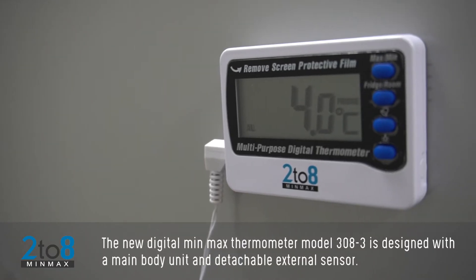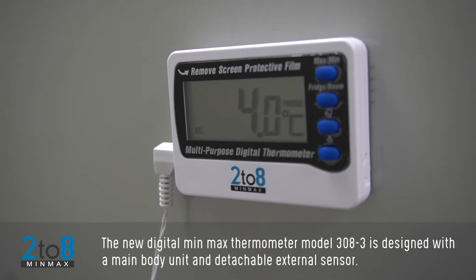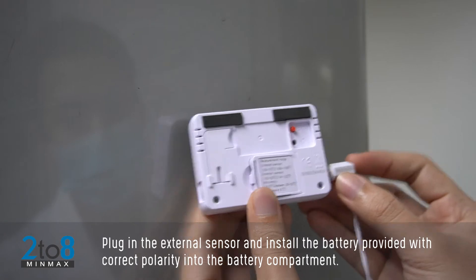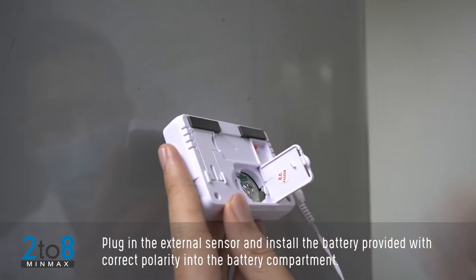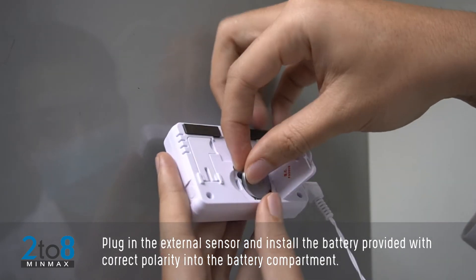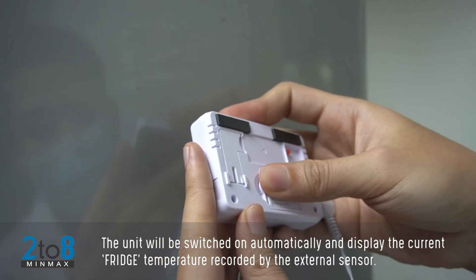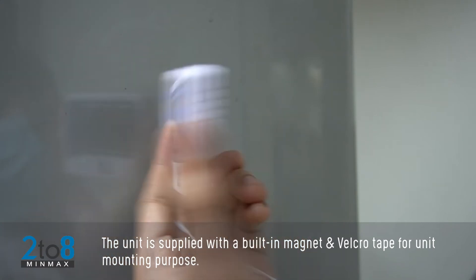The new digital min-max thermometer model 308-3 is designed with a main body unit and detachable external sensor plug. Insert the external sensor and install the battery provided with correct polarity into the battery compartment. The unit will switch on automatically and display the current fridge temperature recorded by the external sensor.